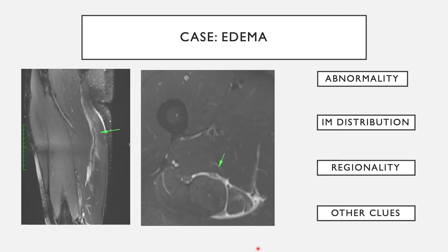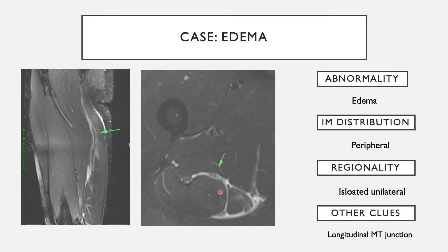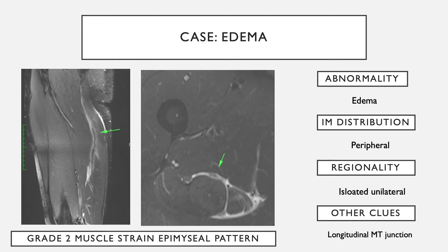Contrasting with another case, there is similar linear edema, but as opposed to the previous case where the edema was along the myotendinous junction, here the edema is along the myofascial junction. It is peripheral in distribution and isolated and unilateral. This is a grade two muscle strain of the epimyseal pattern, where the injury is along the muscle-fascial junction as opposed to along the muscle-tendon junction.